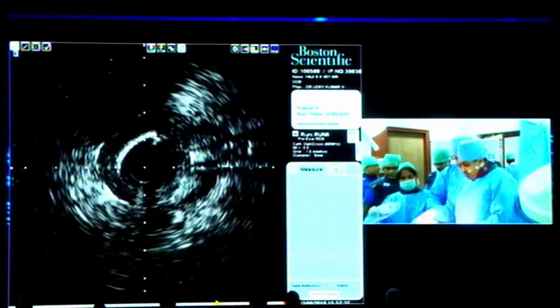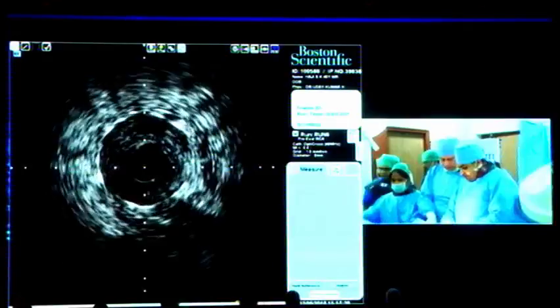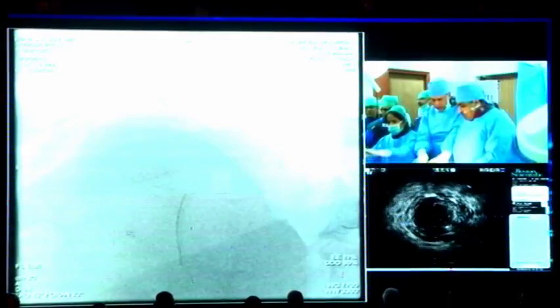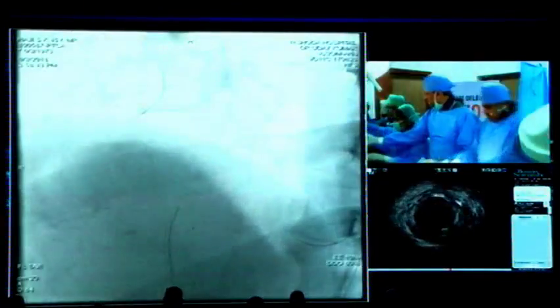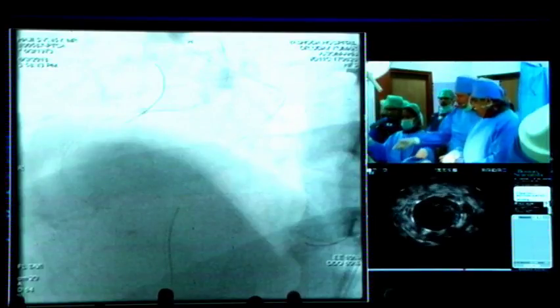What do you think? Yeah, sure. Go ahead. In the meantime, we'll just ask Dr. Asakura, do you do IVUS guided puncture with the 7 French guiding? Can you give me 2.0? 2.12, 2.15. Most of the time, yes. I use the 7 or 8 French if I need IVUS guidance. Yes, we're using a Mini Trek 2.15.